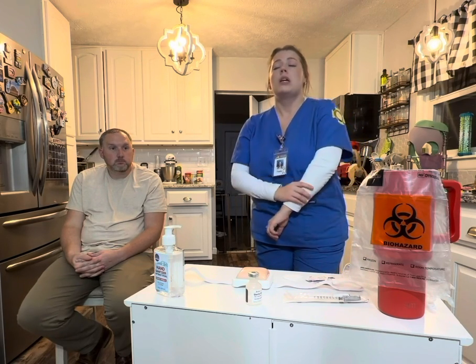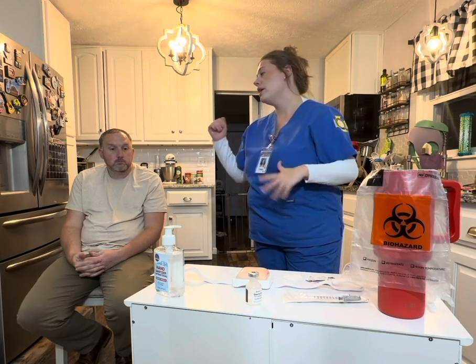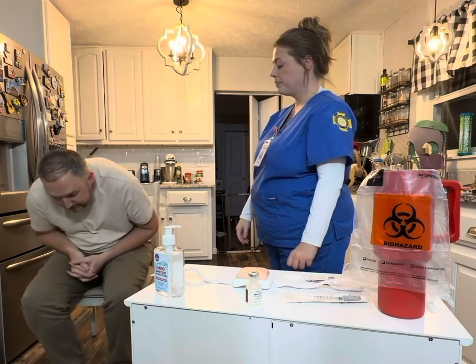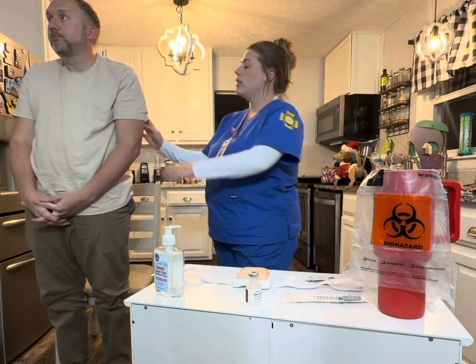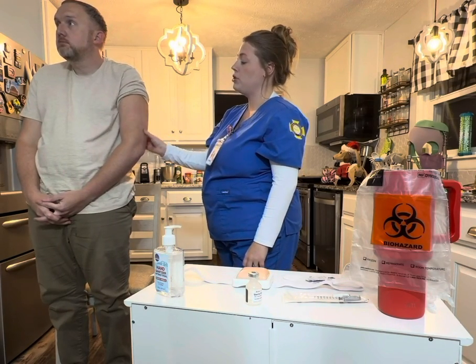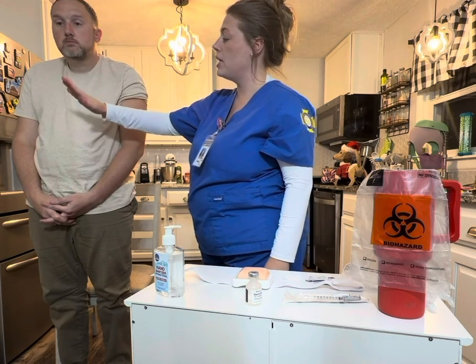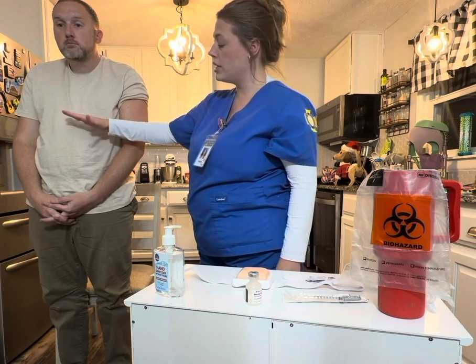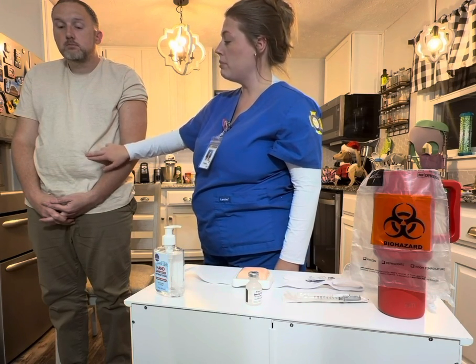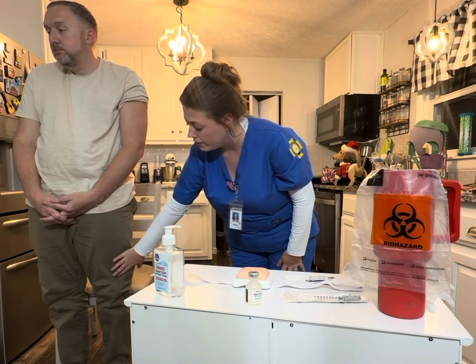So with subcutaneous, there are 5 injection sites that you can give. So I'm going to go ahead and demonstrate where you can give those. Can you go ahead and stand up for me? So first you can give it on the upper outer part of the arm in this extra adipose tissue here. Second, you can give it in the abdomen region from the costal margin down to the iliac crest, 2 inches away from the belly button. Then you can also give it in the anterior upper part of the thigh.